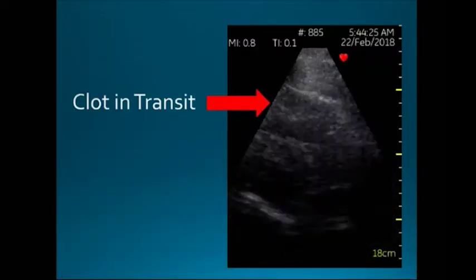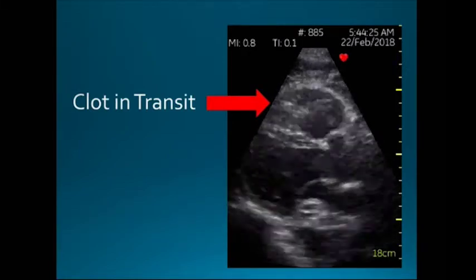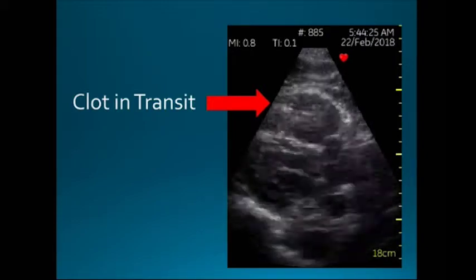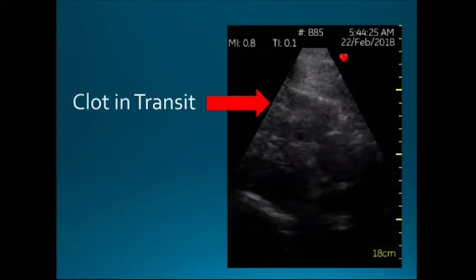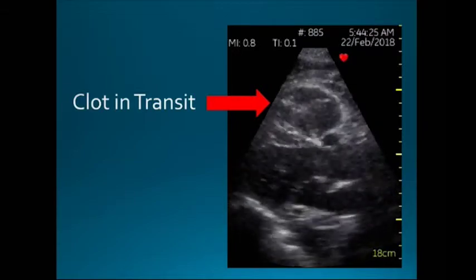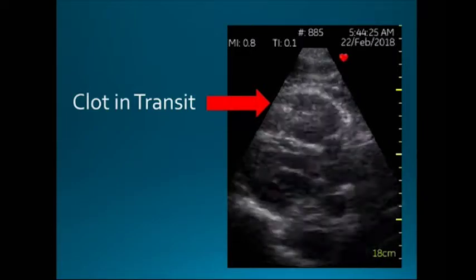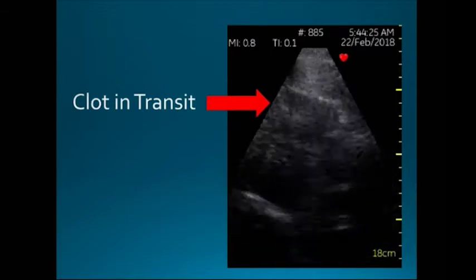This is an example. I love to show this clip because I didn't obtain this clip at all. This is a clip obtained by one of my residents who was on the night wards at one of the VAs and had a guy who was post-operative from a femur fracture, just post-op day 0. So this is the night after his surgery. And he was hypoxic. He had gotten a lot of fluids. They got a chest x-ray. They said there was some congestion on the chest x-ray. So they were diuresing him, and he wasn't getting better.